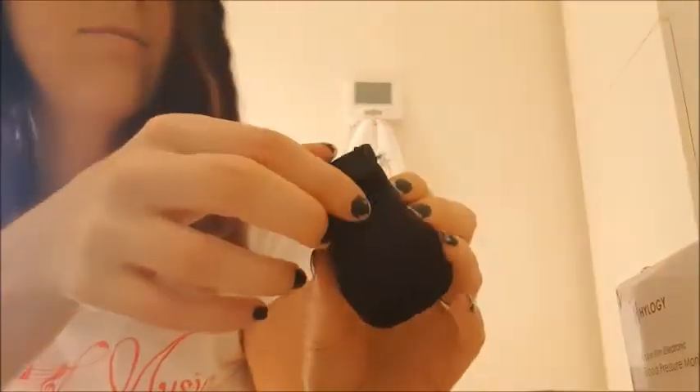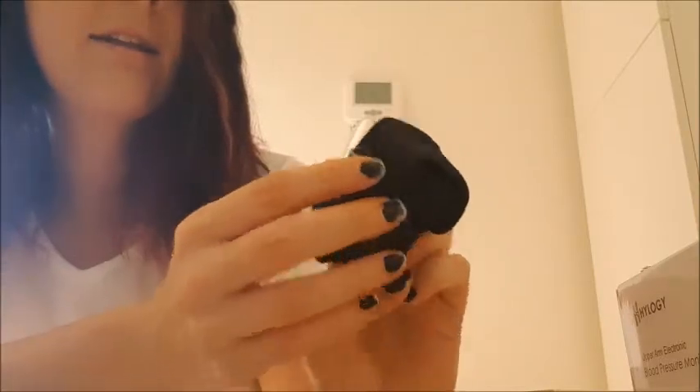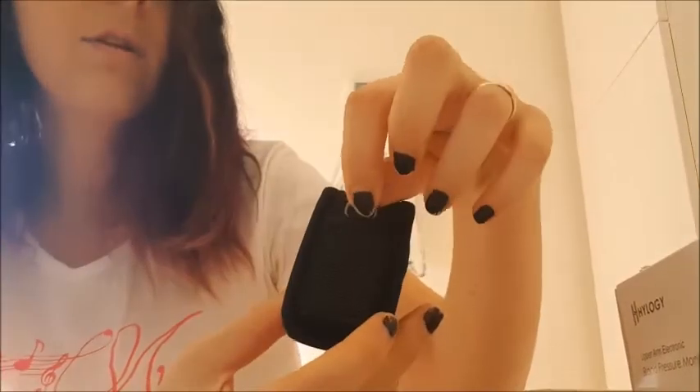It comes in a little black case, and I guess you could take it with you — like clip it around your neck if you wanted to. And here it is.